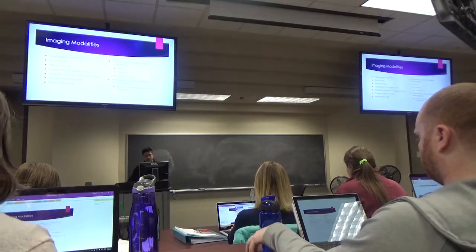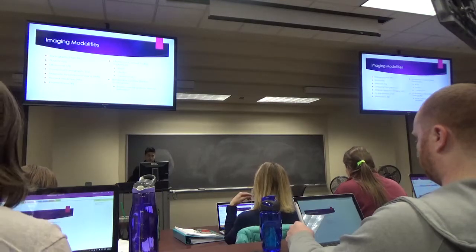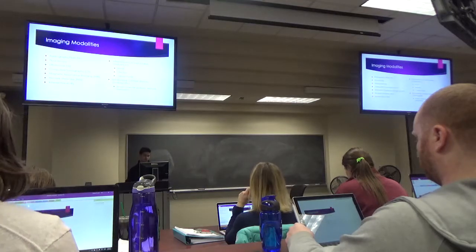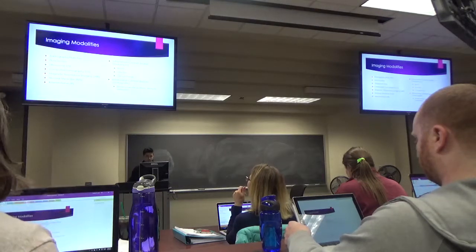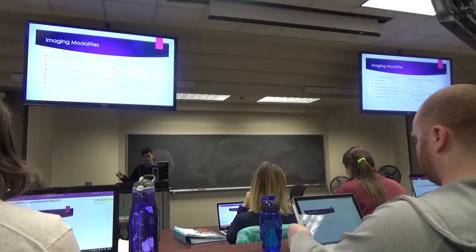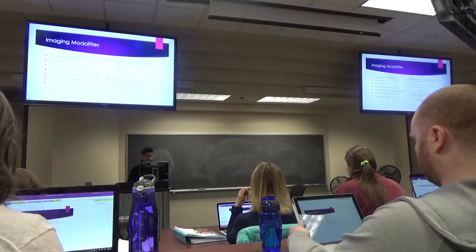We generally give contrast for specific reasons. We look for blood, infection, cancer, tumors, things like that. And when I go over some cases, especially when I come back for GI and peds, you guys will know exactly when you should give contrast or order it, with contrast or without. And there's also intraluminal contrast. This is stuff that we either ingest orally or we use a rectal catheter called an enema, and then we can look at the bowel lumen and things like that.